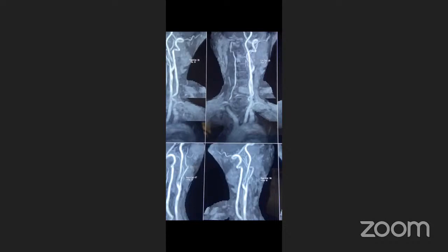We will do the subclavian first. The complication rate with the subclavian is very, very low. Second, the vertebral is flowing retrogradely, so the blood going up through the hypoplastic artery is very little. The chance of embolization from the subclavian to the vertebral to the basilar is almost zero, because the flow is totally retrograde. Third, in this case, I wanted to cover the right vertebral ostium also, so that nothing should go up.